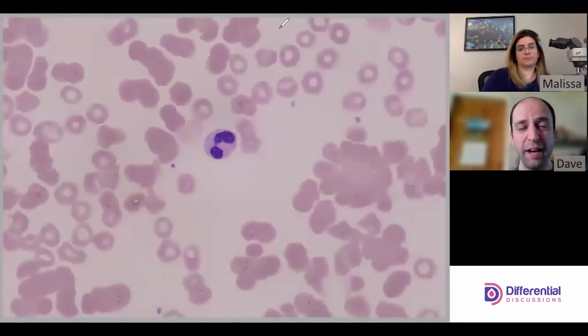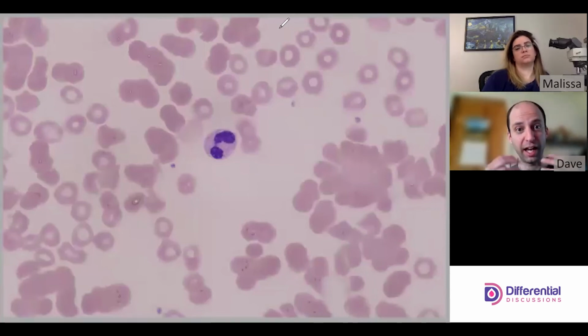I would imagine some institutions might have procedures for how to report this, and that might vary from place to place. Absolutely. I've read in the literature, you can warm the slide, warm the sample before making the push prep, so you can get a look at the red cells as they are. But then, part of me also wants to make sure that agglutination is reported.